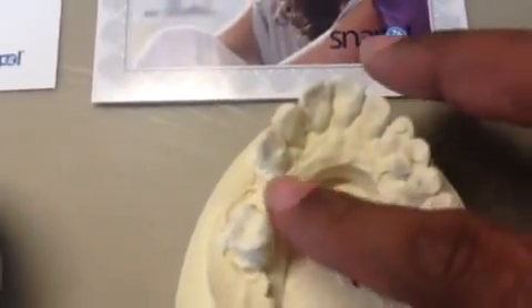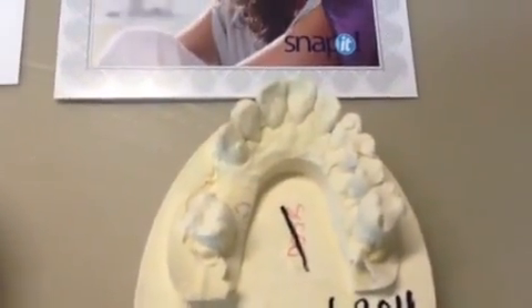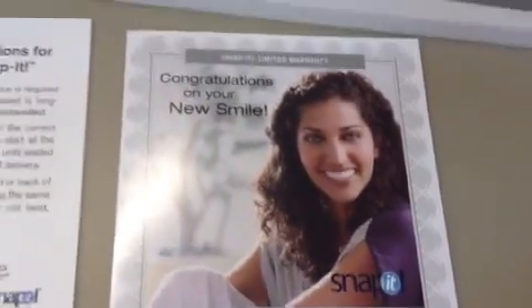We didn't want to make a denture, which would obviously cover all of the roof of his mouth and make it uncomfortable to eat or drink. And this is the actual snap-it brochure.